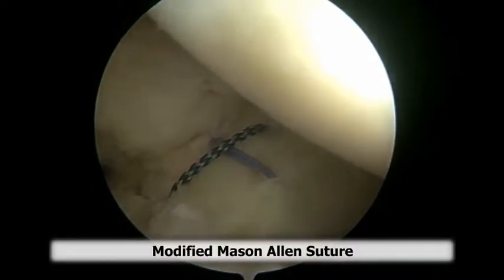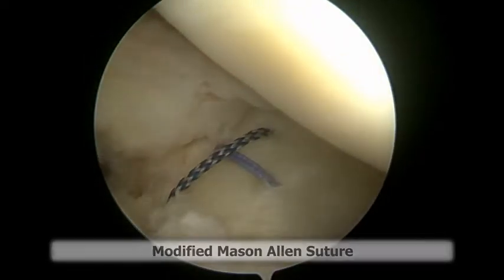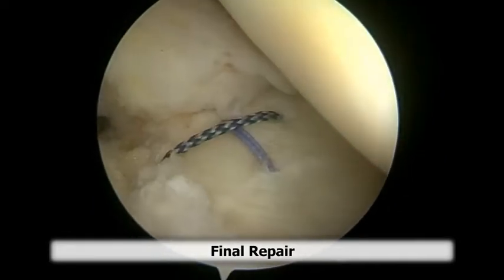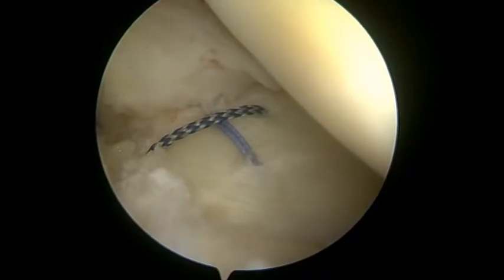The sutures will then be tied over the anterior surface of the tibia, and here you can see our final repair. This is a modified Mason-Allen type suture, and it is important to see nice compression of the medial meniscus into the repair site, as you see on the video.